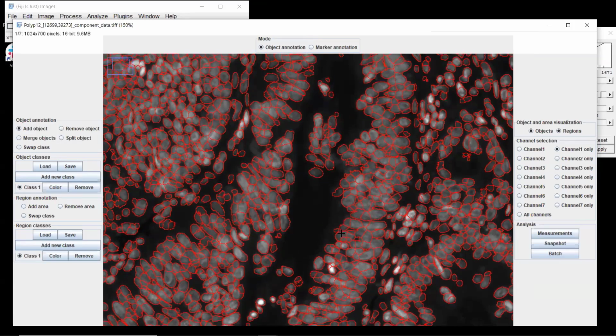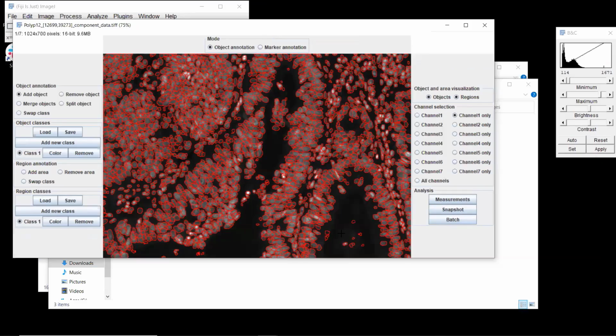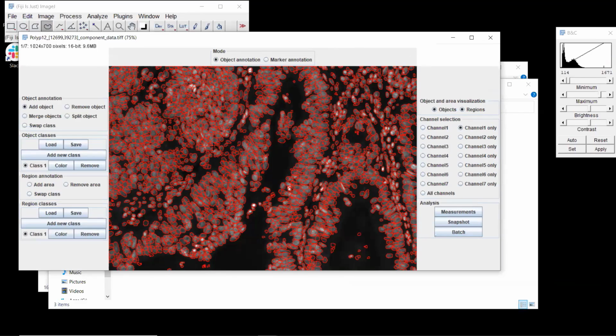So here you see that by using an existing segmentation, you're going to save time, even though you might have regions where it doesn't work well. Basically here, it works well in the stroma, and in the epithelium, not that well. And when you have a really tightly packed region like this, not great. But that's going to be already a little faster than just doing everything again. So now you can just load the segmentation, play a little bit with it, and just see how it responds.